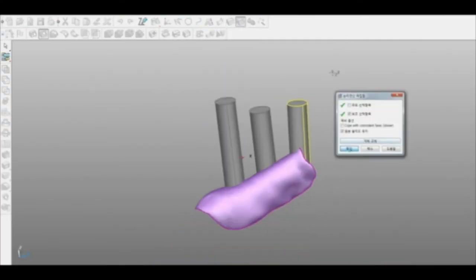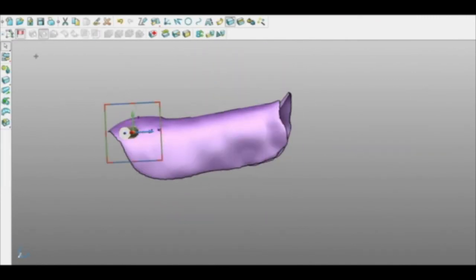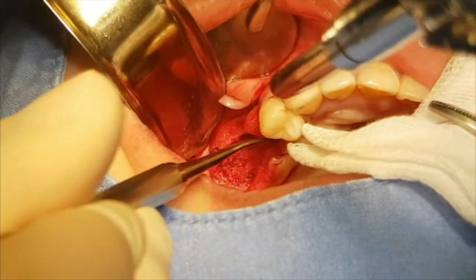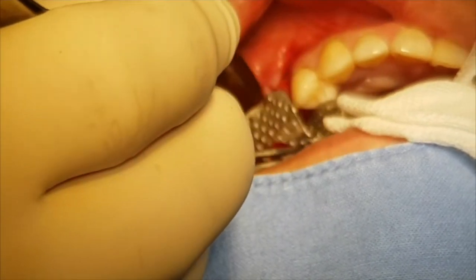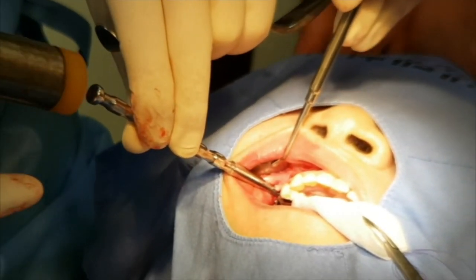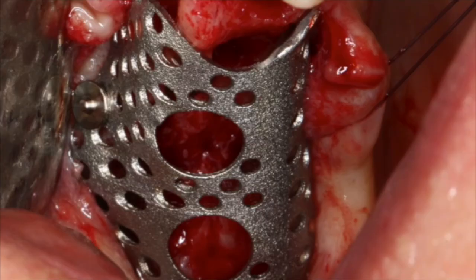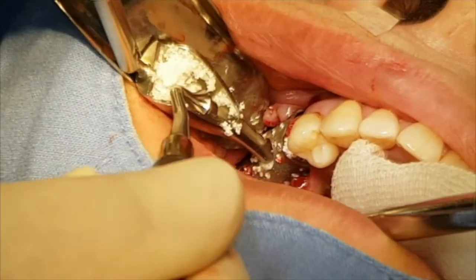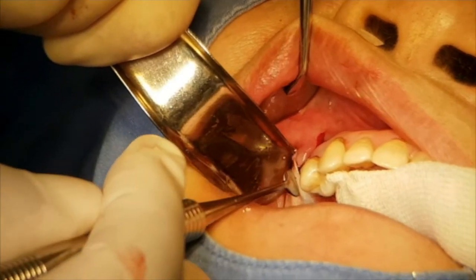If we do the implant surgery with GBR at the same time, titanium mesh will be the key to successful surgery. Professor Jung at my university did the surgery. The mixture of autogenous bone and Osteon 3 was prepared for GBR. The patient-specific membrane was placed and fixed with pins. After the graft material filling, the surgical site was covered with a collagen membrane.